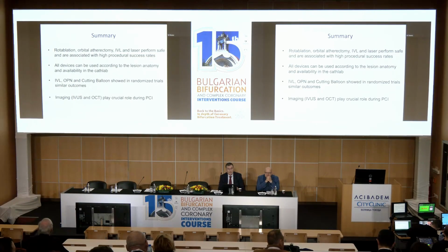So dear colleagues, rotablator use, orbital atherectomy, shockwave, and laser, performed definitely safely in experienced hands, are associated with a high procedural success rate. All devices can be and should be combined according to availability in the cath labs.